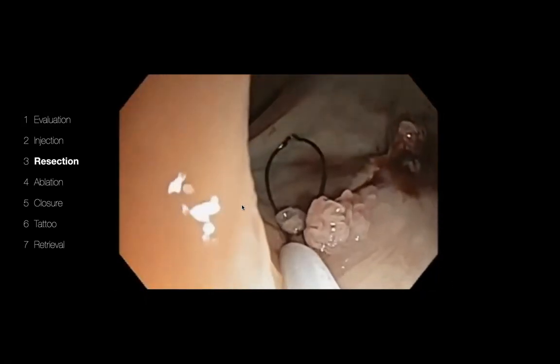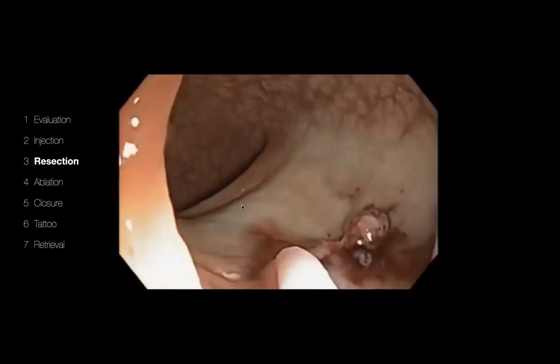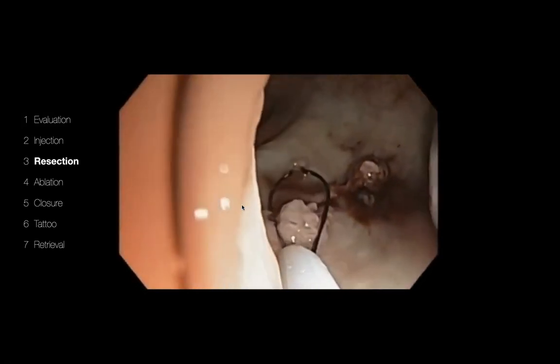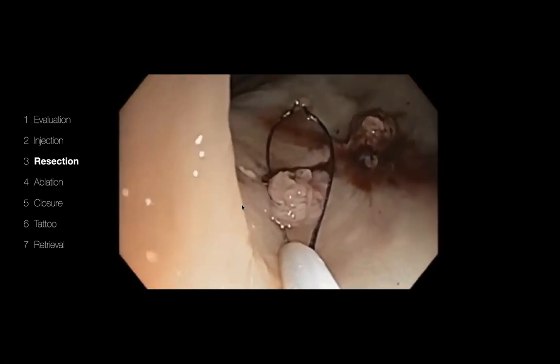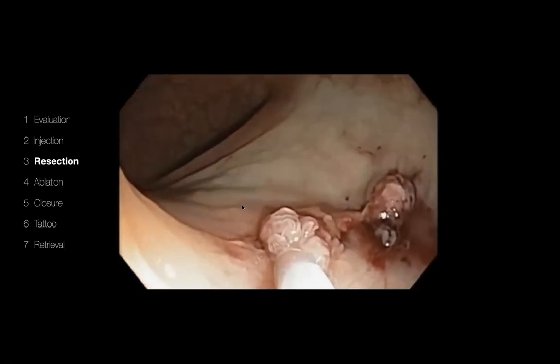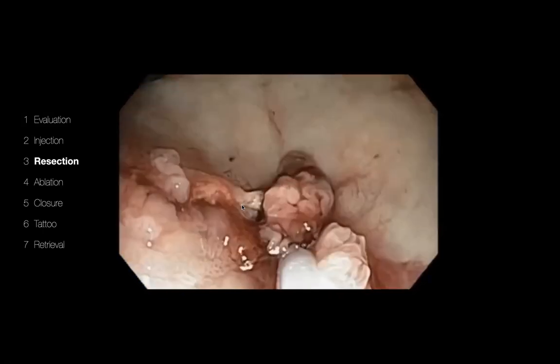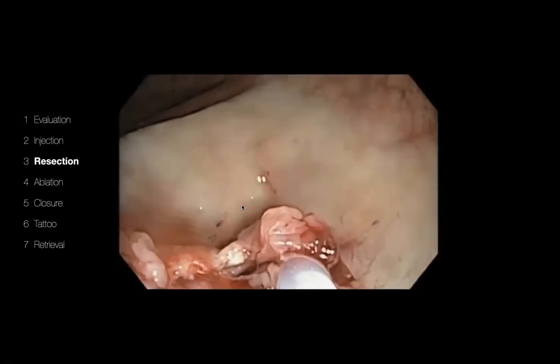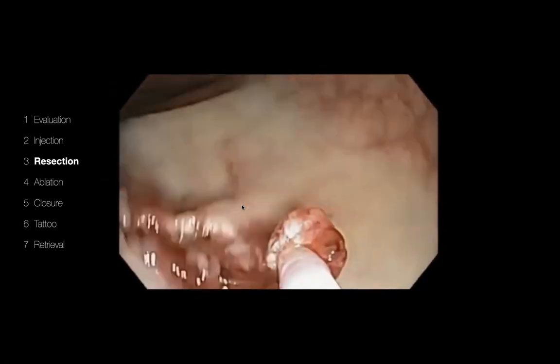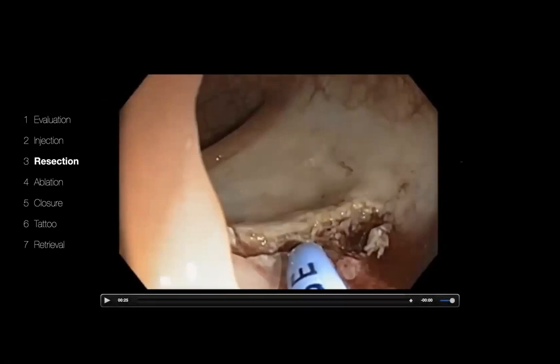So we went ahead and resected the remaining polyp. And it's important to make sure that you resect the remaining polyp completely and make sure there's no visible residual polyp. And do not get into the idea of trying to ablate this with APC, because you cannot really ablate this and the polyp is going to come back. So any thoughts on this, Chris?